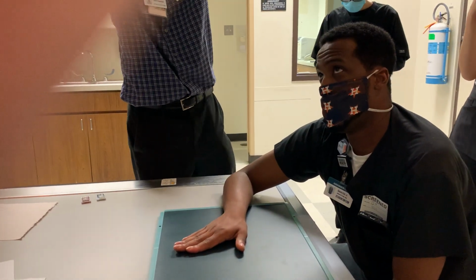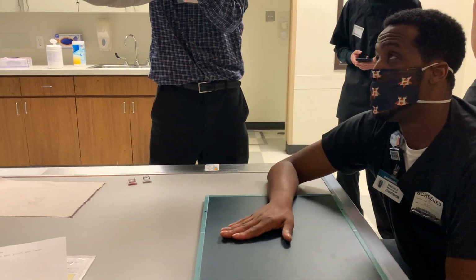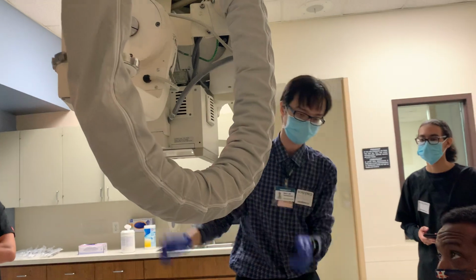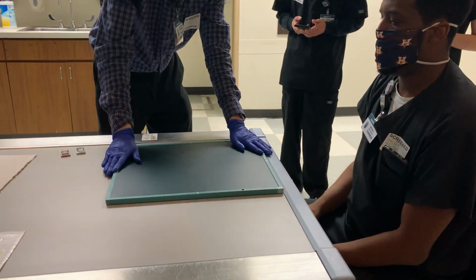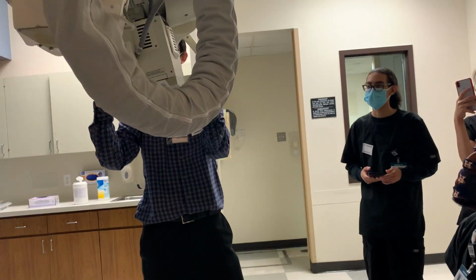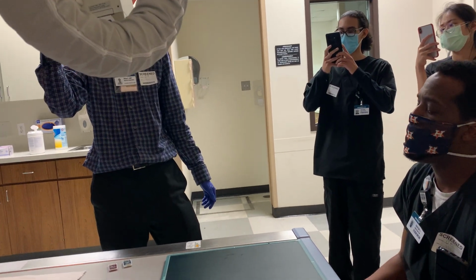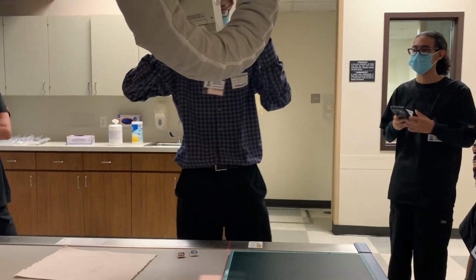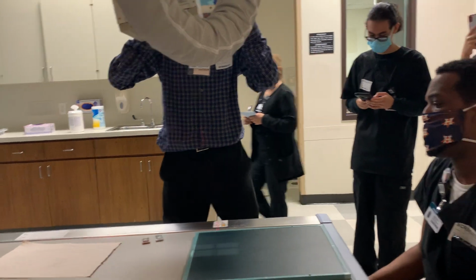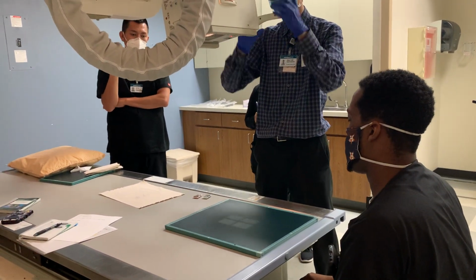Personally, I think straight arm is easier. For most patients, I think it is more comfortable. So we're going to go to straight arm method. So relax your hand. So 10 to 15 degrees. So for this one, I'm just going to leave this at 10. Make sure that you do recenter, because anytime you angle, your centering is going to now change.